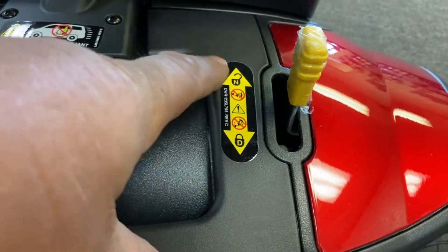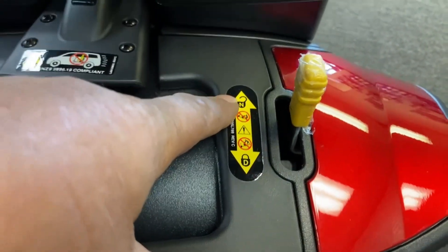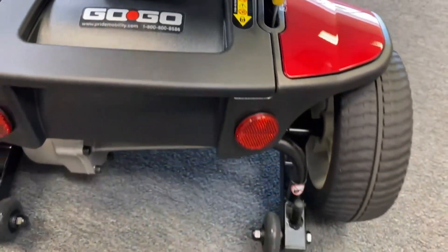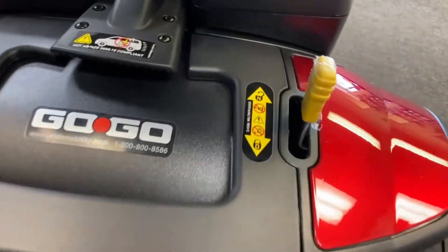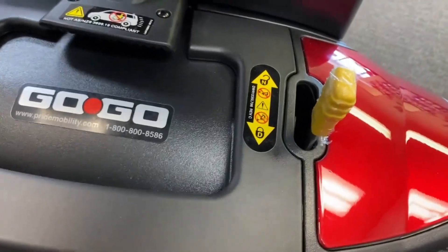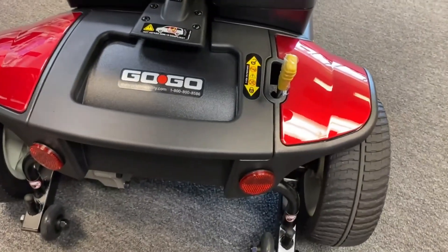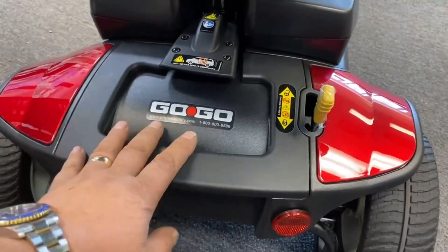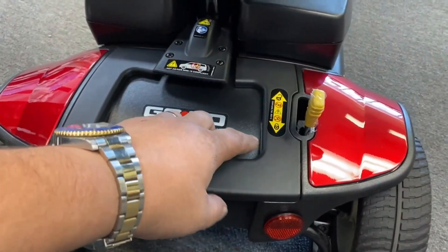Basically what that means is when it's unlocked it's in neutral, same as your vehicle — put it in neutral and you can push the scooter. But when it's in the drive position, that engages the brake and stops the scooter from moving, so it's locked. Even if you take the battery out, it will still be locked, so it won't roll away from you.